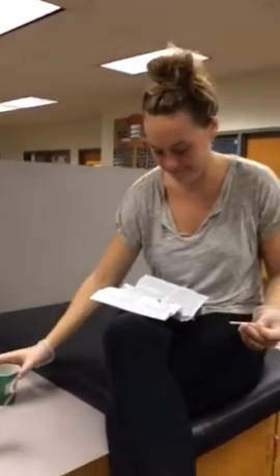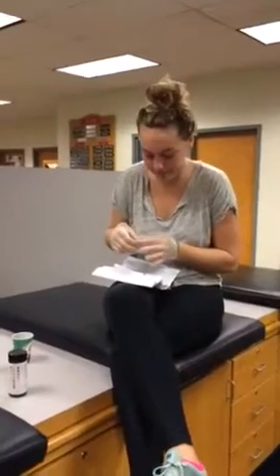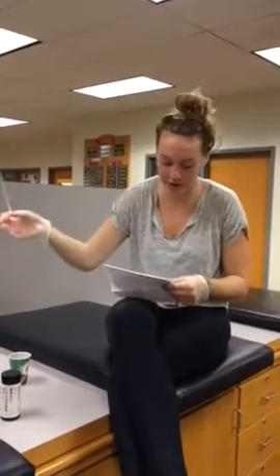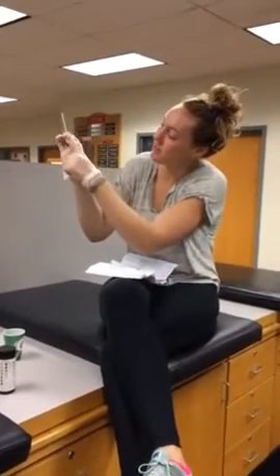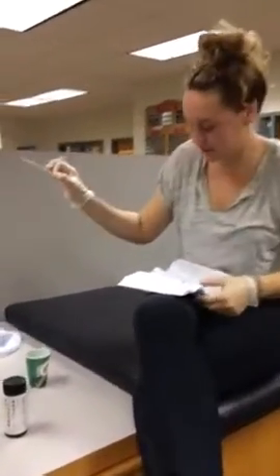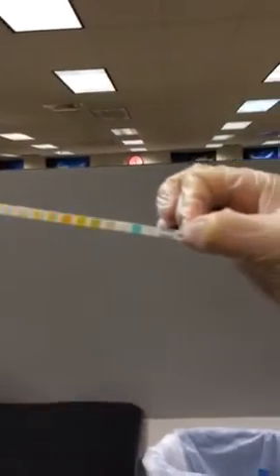Next, collect a fresh urine sample. Mix well, but do not centrifuge it. Remove the strip from the bottle and replace the cap. Don't touch the test pads — otherwise, you can contaminate them.